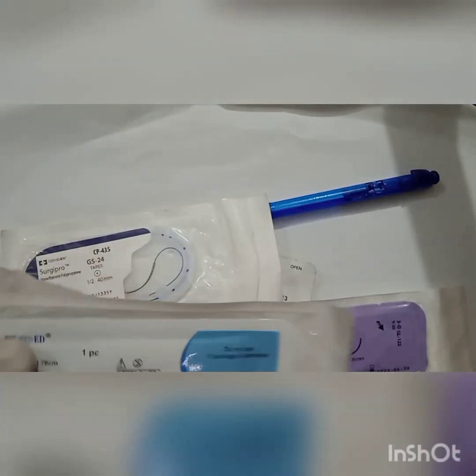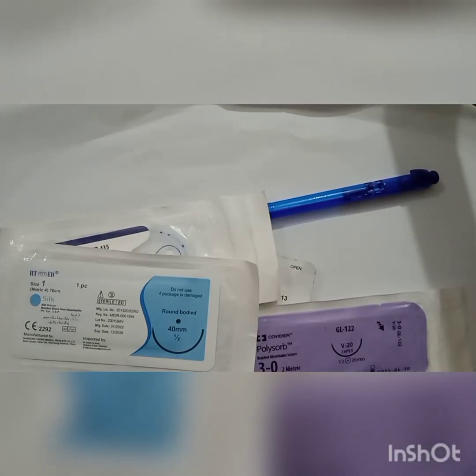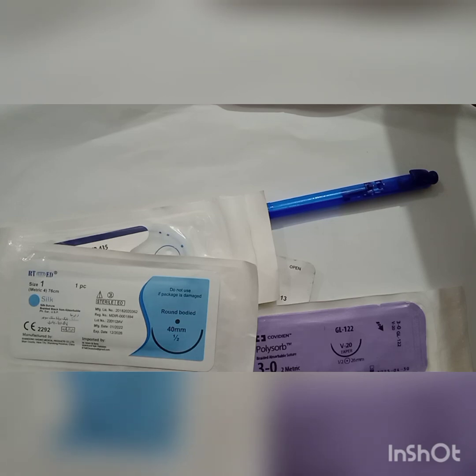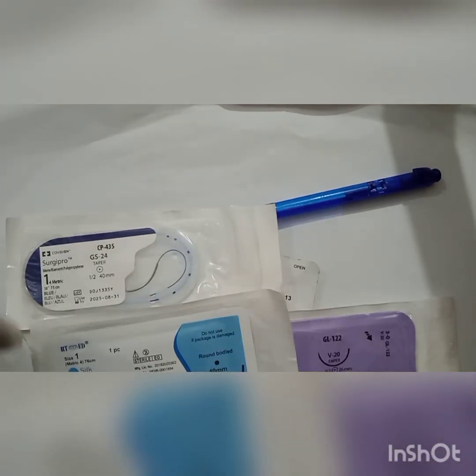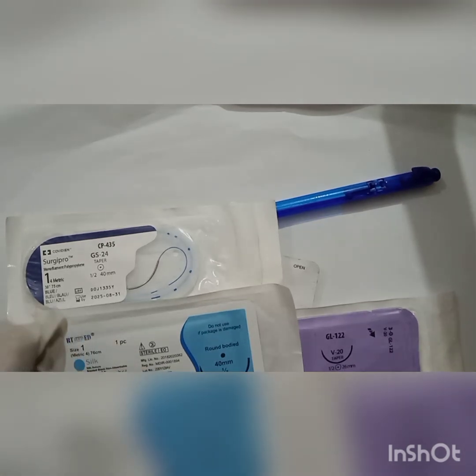Different sutures have different properties, like duration of absorbability, tensile strength, allergic behavior, carcinogenic behavior, infective behavior, capillary action, and others. Basically, suture materials are classified on the basis of absorbability.